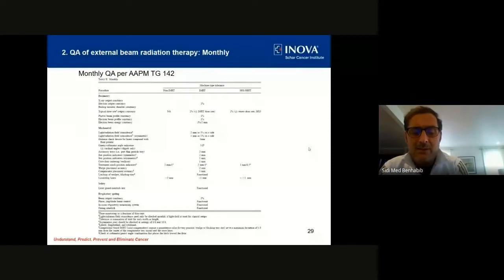So the monthly QA. The daily QA, I would say, takes about 30 to 45 minutes, but the monthly QA takes more time. Actually, I apologize, but I forgot to mention that for the daily QA, because we have Varian machines, we started exploring the MPC, the Machine Performance Check. It is a very good tool provided by Varian, but it does not replace the daily QA that has to be performed, and this has to be very, very clear. It is a tool to check all the mechanical deviations, but it cannot be used for output check.